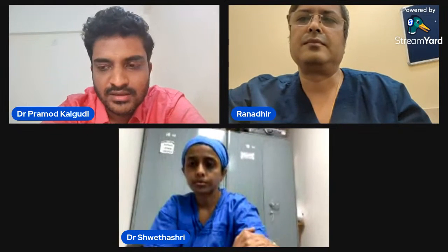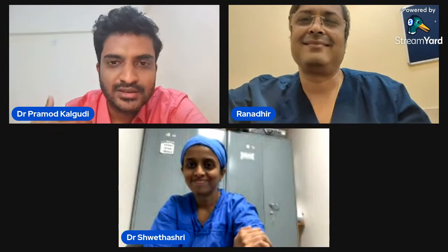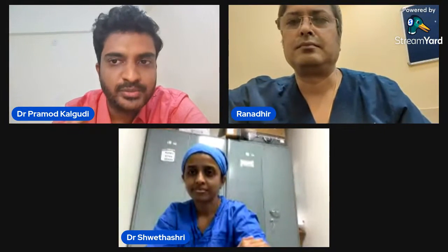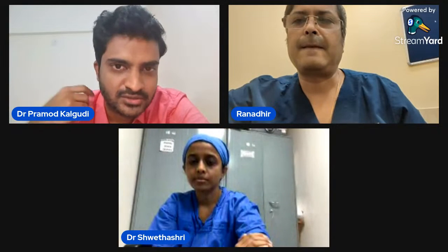So we do it routinely on most of the patients. Just to be honest, it does not matter at times. Sometimes we do it for the practice, because it has a very steep learning curve. You don't want to unlearn what you have learned. So even if you know that the patient is normal, does not have any symptoms, or let's say a GB syndrome patient, I still want to look at his internal carotid and external carotid. We do it routinely for all the patients who require it.